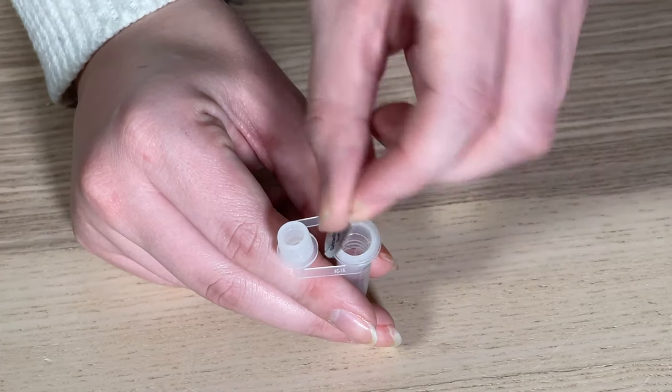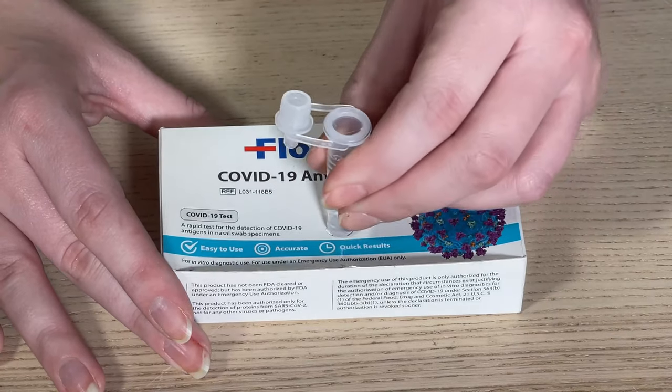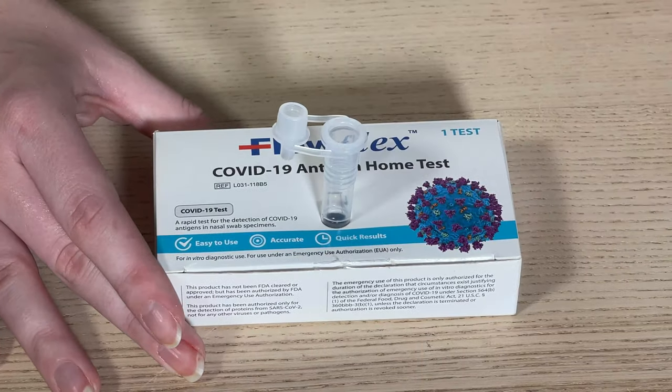After you are sure you have everything, remove the foil from the top of the extraction buffer tube. Using the bottom of the extraction tube, punch through the perforated circle on the box and place the tube in the hole.